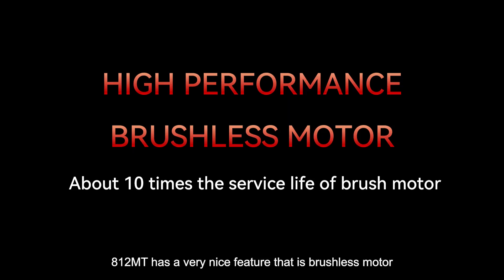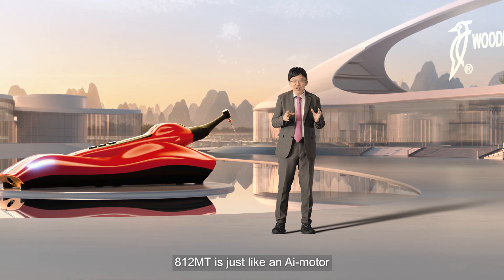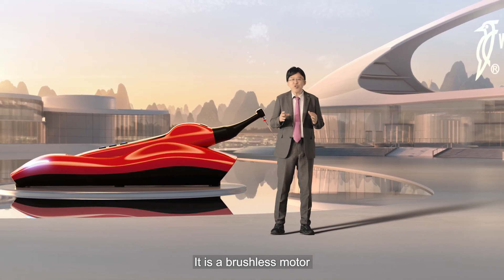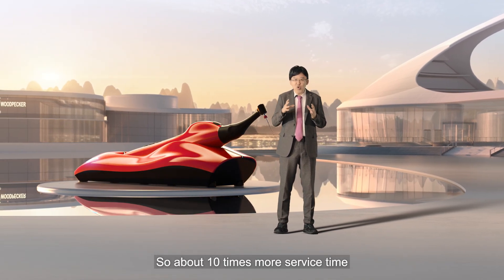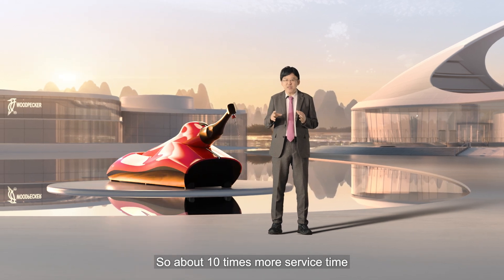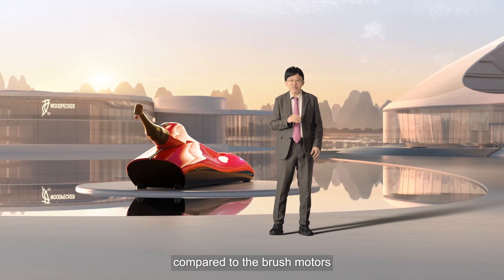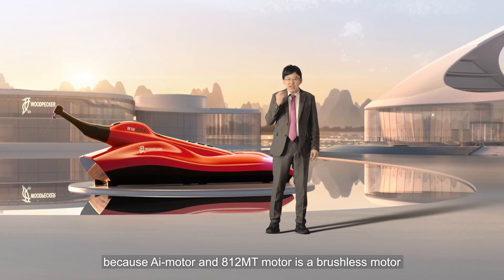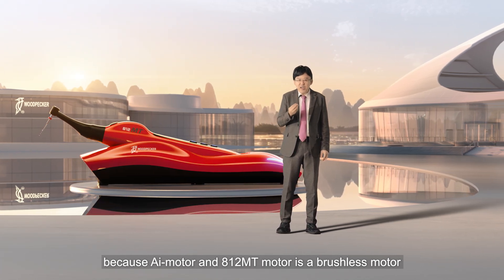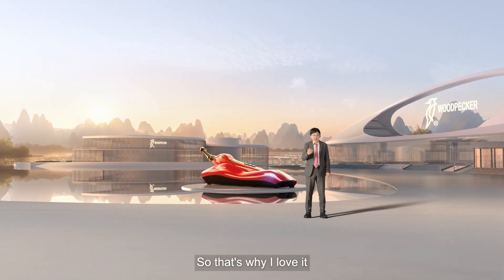812 MT has a very nice feature: it has a brushless motor, just like an AI motor. It offers about 10 times more service time compared to a brush motor, so it has a much longer life. Because both the AI motor and the 812 MT motor are brushless motors, that's why I love it.